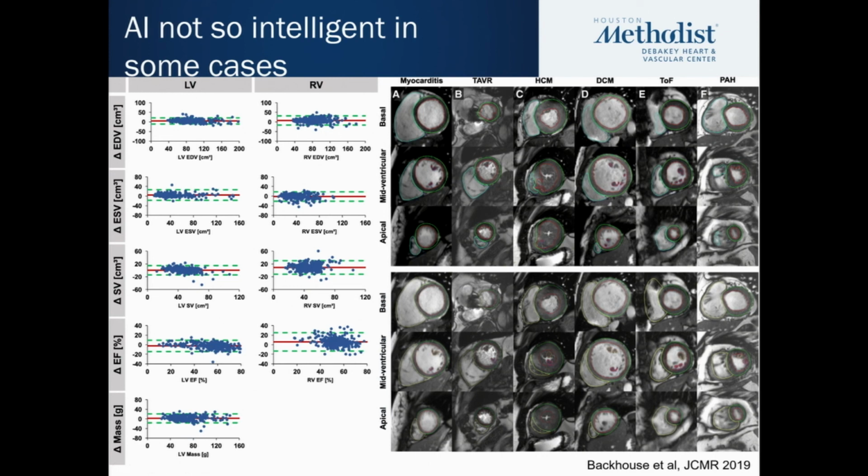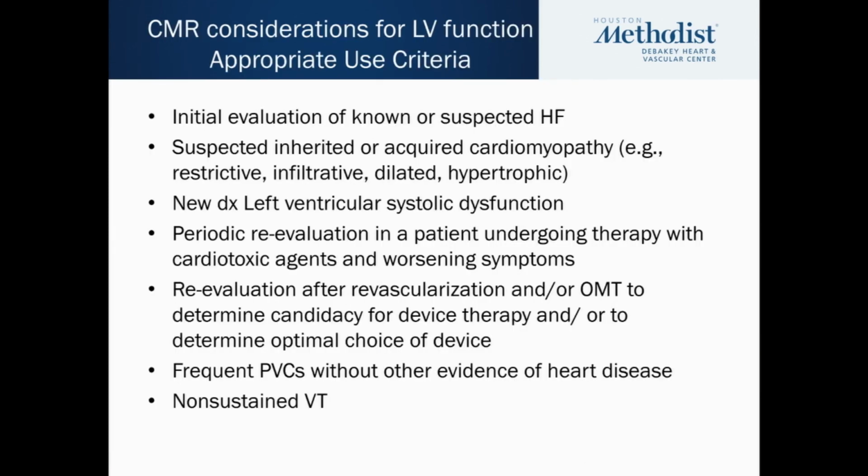I imagine that with more improvements in exam speeds, let's say your lab is doing 10, 15 studies a day, it's reasonable to trace manually. But let's say your exam duration now goes down to 15 minutes, 30 minutes for some cases. It's going to be hard to trace all of these cases manually. It's going to add a lot of time. So more to come, and I think I will end here.